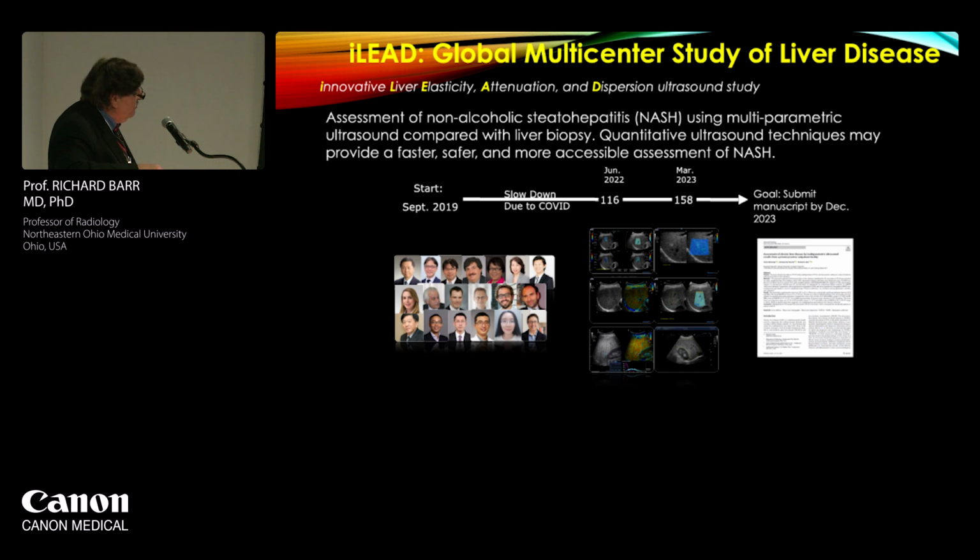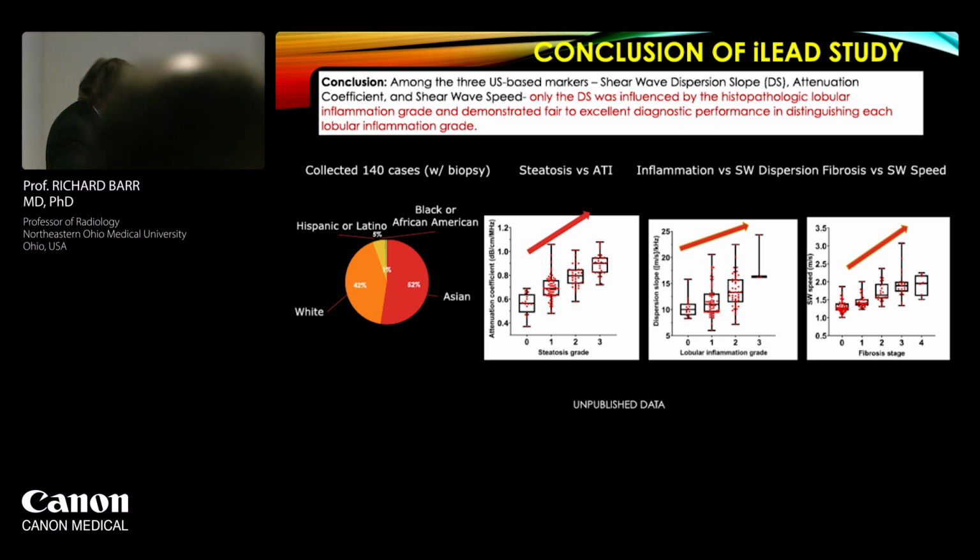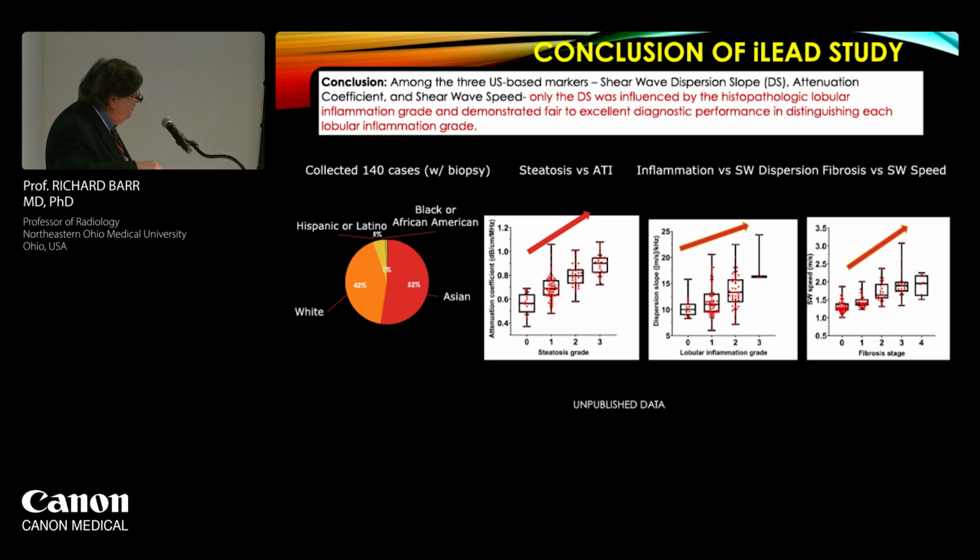We have some older papers, but again, we're going to have hopefully a new submission by the end of this year or beginning that shows that there is a reasonable relationship to shear wave slope with inflammation in addition to other things. And again, this is his unpublished data that he'll be showing on Thursday. But you'll notice that the steatosis grade goes up based on attenuation coefficient. Very good correlation between attenuation coefficient and steatosis grade. The dispersion slope seems to correlate with lobular inflammation and grade, and our shear wave speed does correlate with fibrosis.